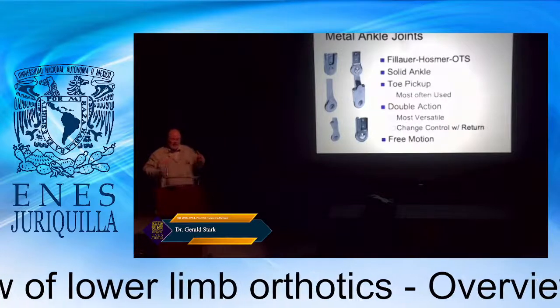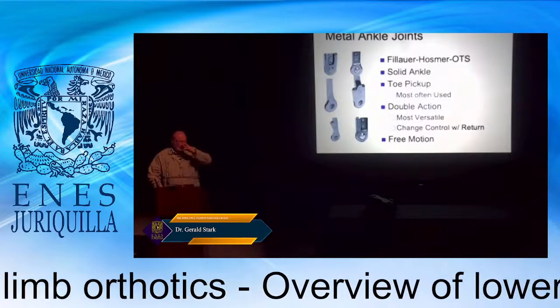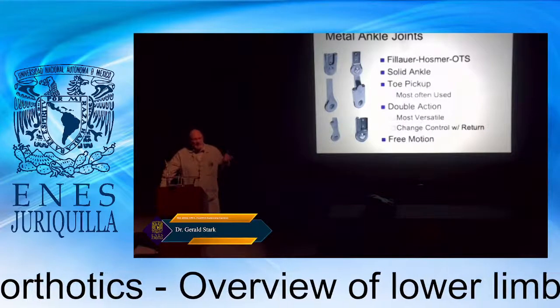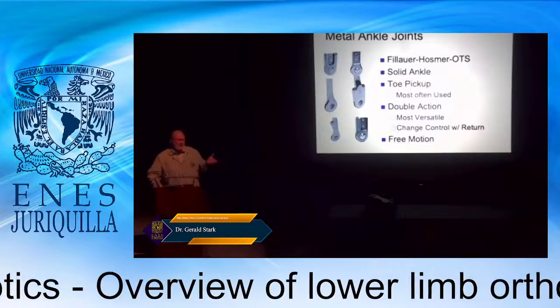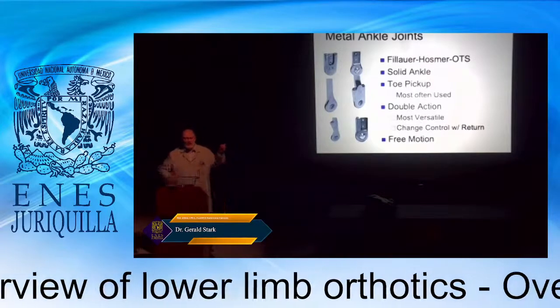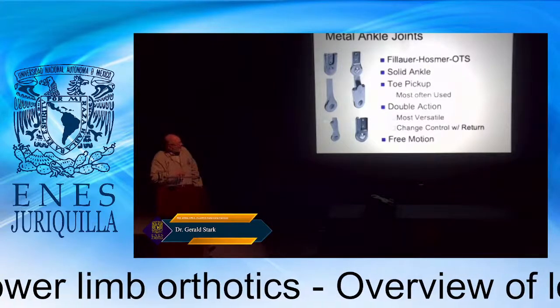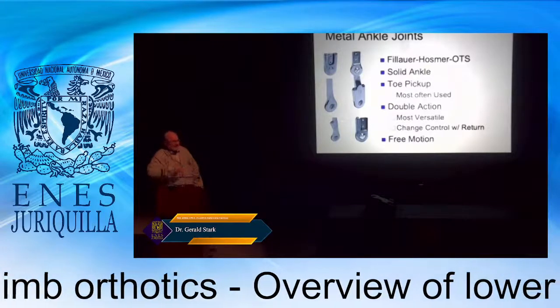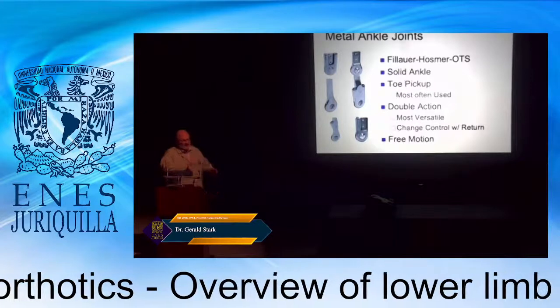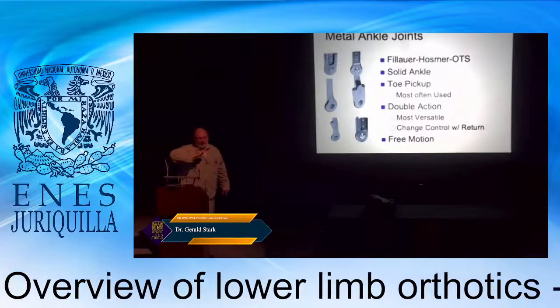So normally there's different combinations depending on what the patient would like to do. The issue is, though, most of these are just preventing motion. It's not like using carbon devices that allow actually more energy to place into the system as you move. These dorsi assist. This is providing dorsiflexion assistance where the spring is posterior and lifting the foot up.